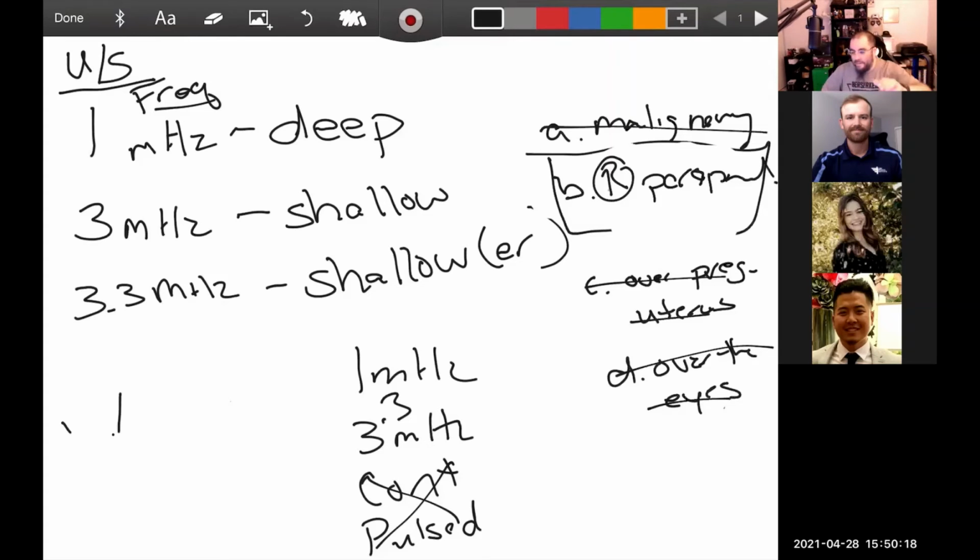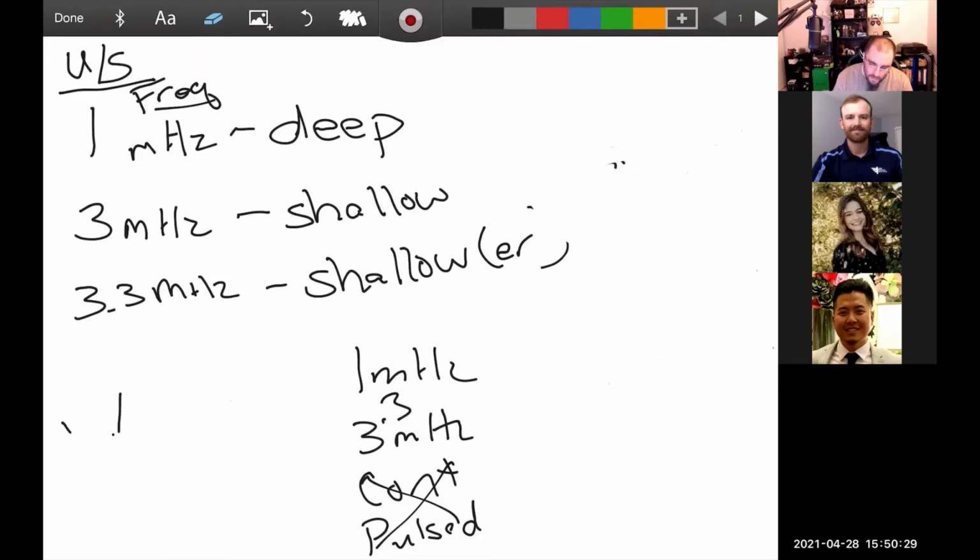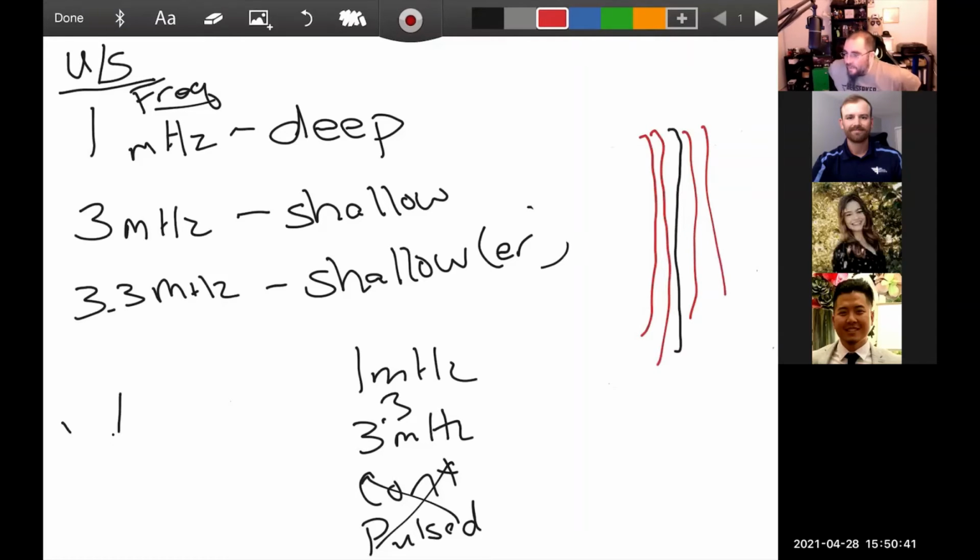We're avoiding that, because when you've got your spine, and you saw that with Dr. Johnson, let me get a place to draw here. I really like this fact that I can draw now. This is going to be my new toy. So we've got our spine coming down the middle of our back. On either side of the spine, we have divots. Those are the areas where if you reach back you can put that space in, and you've got your pedicles and everything. In those divots sit your muscles. If you're on those, you're okay, because usually at that point, the nerves are already past the horn cell, so you're safe.